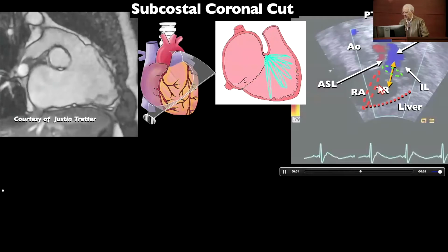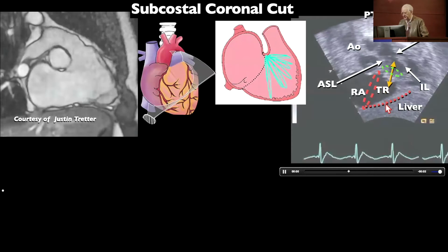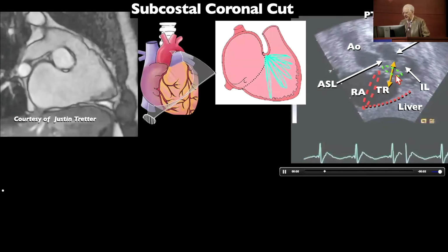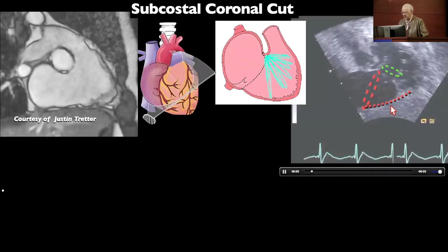And you can see the annulus, the septal leaflet, the inferior leaflet plastered against the myocardium here. So this is all atrialized ventricle. There's the true effective orifice of the valve and the regurgitation going down towards the apex of the ventricle.